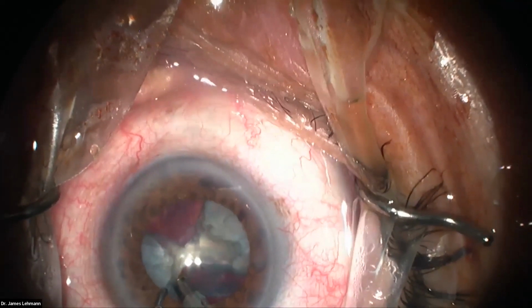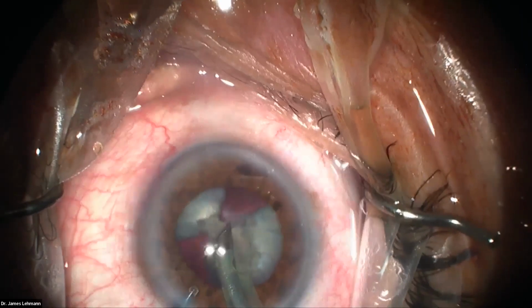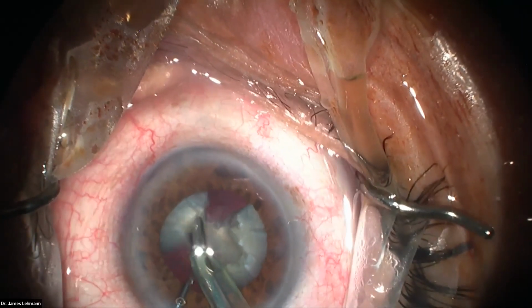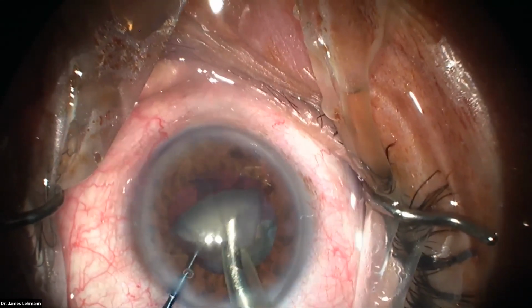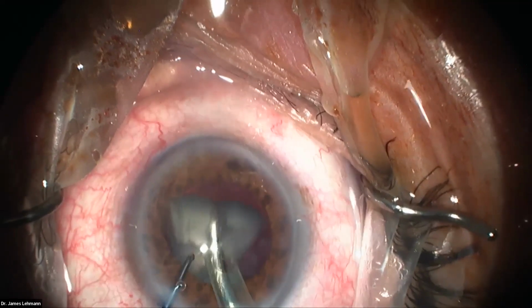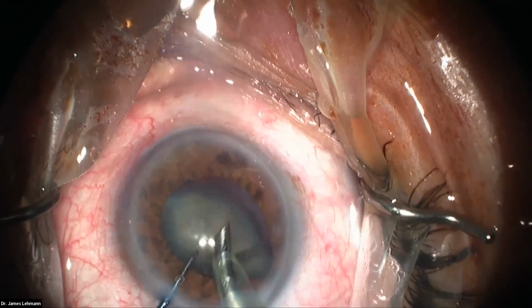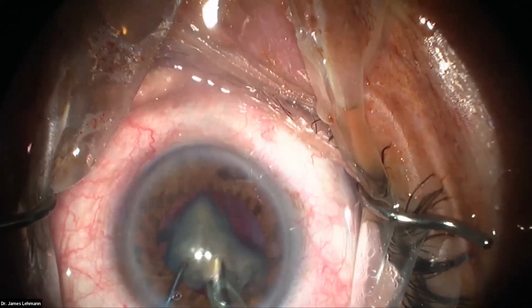Okay, so I like this piece. I'm going to push it back. I only go and grab things that are across the chamber from me. I don't go trying to grab here. I don't go trying to grab there, just across the chamber. And now I'm going to lift that little piece up, eating in the iris plane. It's kind of attached to that last piece, so it's going to come up as I'm eating this quadrant.